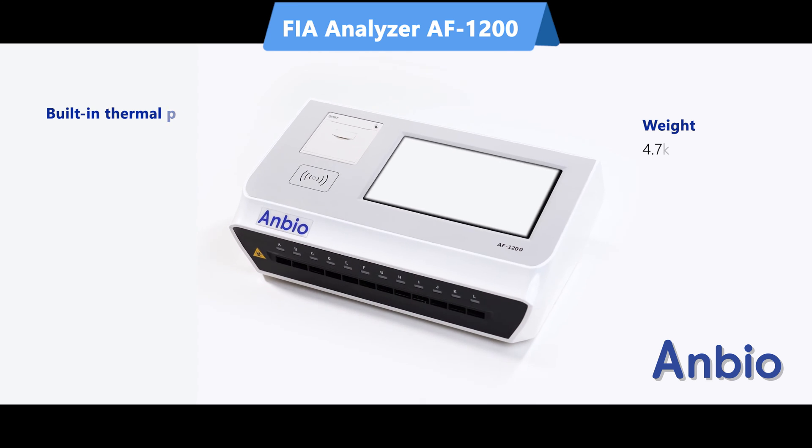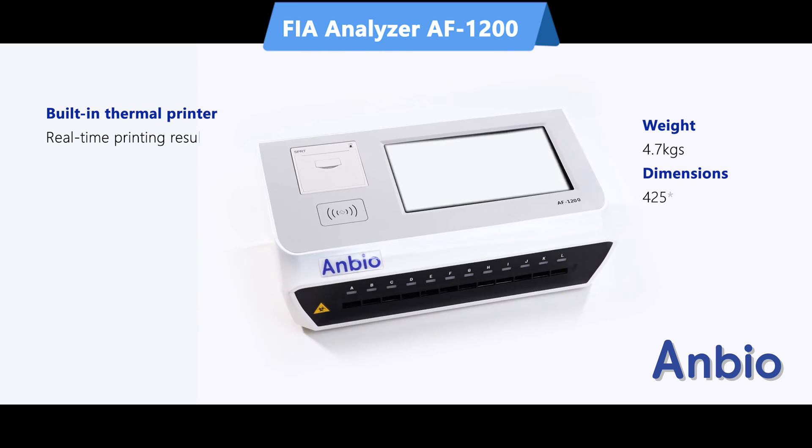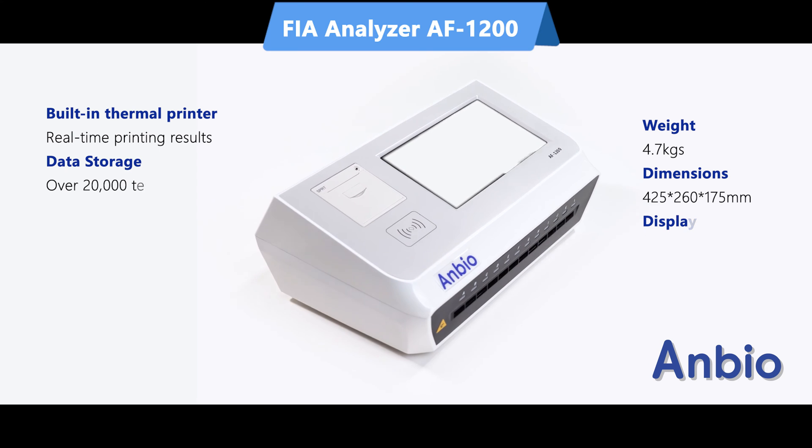Welcome to the world of advanced diagnostics with the AF1200 Immunofluorescence Analyzer.